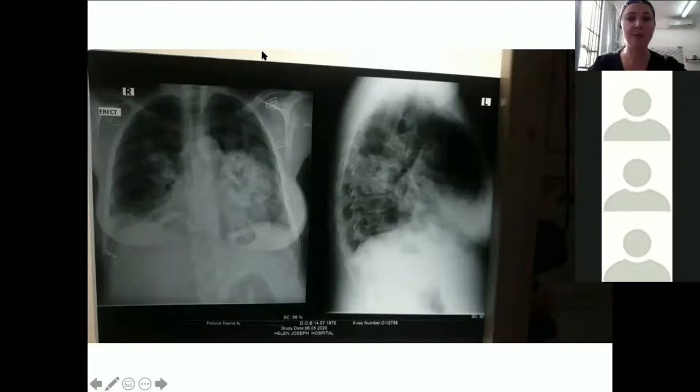What are we seeing on top of the gastric bubble? Okay, here, so is this what you're looking at? These kind of artifacts over here? Yes, okay. That looks like the back of a bra strap. It looks like we connect those at the back. So it looks like you've got bra straps over here, and I think that's just a strap that goes around the back.